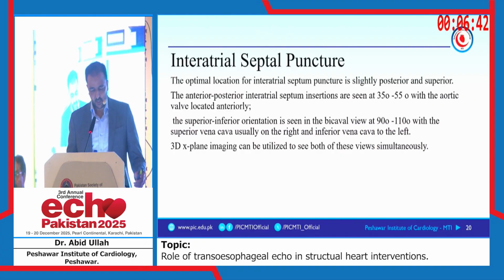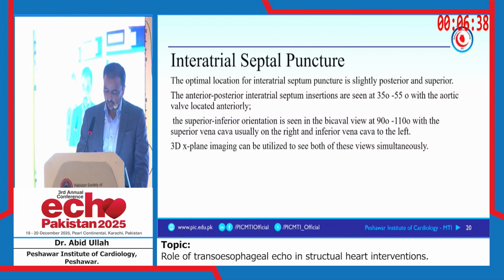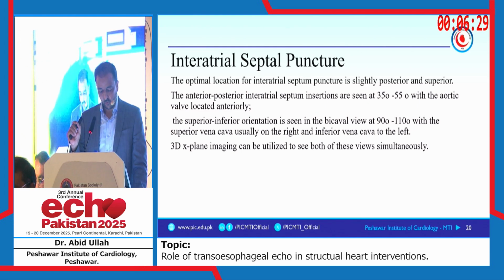As I said, the interatrial septal puncture is very important, and you need to assess it and plan it very properly. It has to be posterior and superior, and there are 2 views for that to make sure that we are going in the right place.